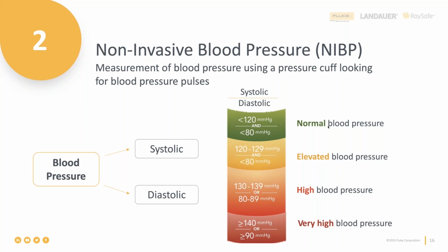There are two main methods of measuring blood pressure non-invasively. The first one is manual, something that everyone experiences during their regular checkups. The other one is connecting the patient to an NIBP device, which is exactly what we'll be discussing today. Normally, a patient gets connected to an NIBP device when hospital staff needs repeated measurements of their blood pressure. Typically, this happens during a medical procedure, like some surgeries, or for continuous monitoring of a patient's state.